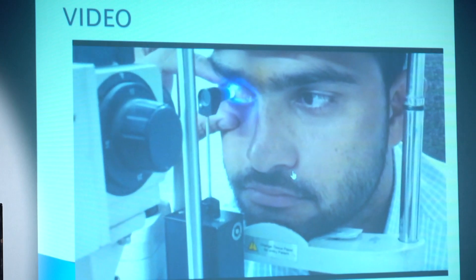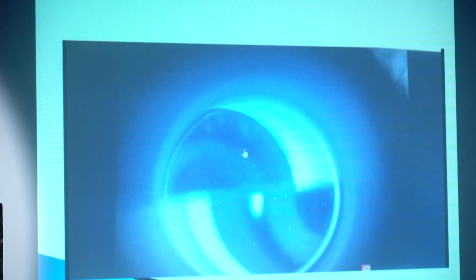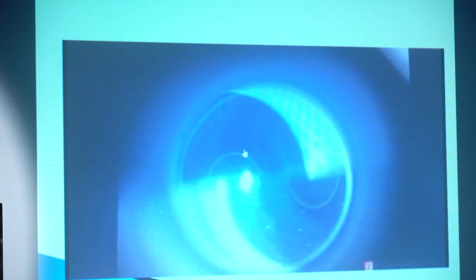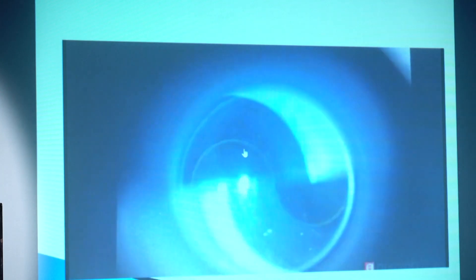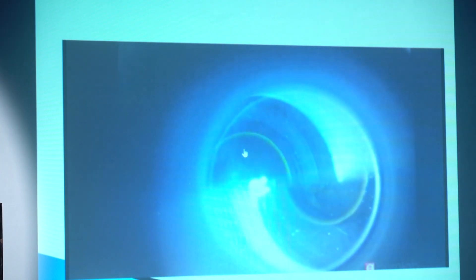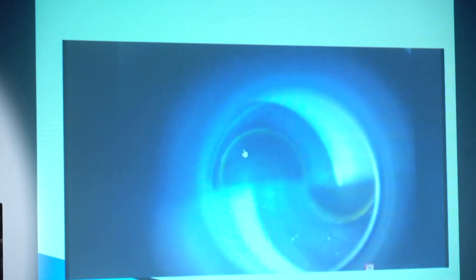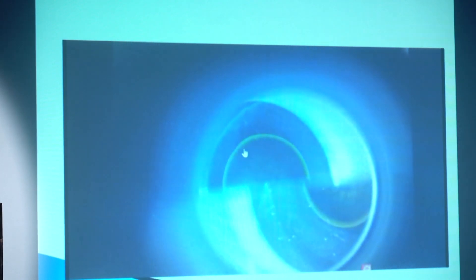Now I will show you another video. This is a prism. You can see the mires and I am trying to make proper alignment — this fluorescence is a little thin. I asked the patient to blink 2 to 3 times. Again the fluorescence is nicely visible. You can get a good mire reading and align the inner parts of the upper and lower mires.